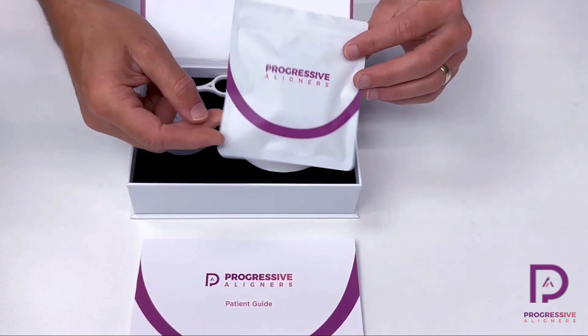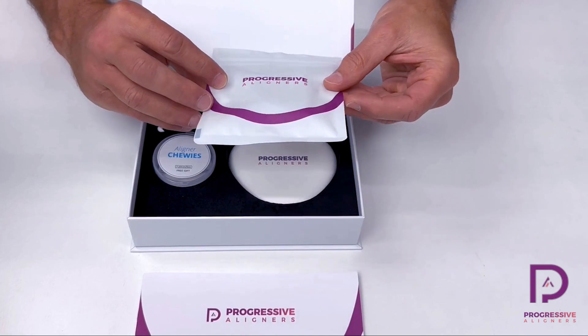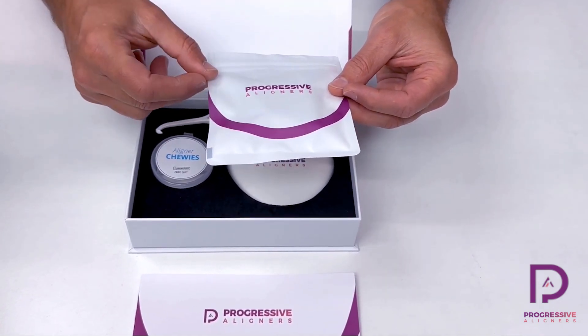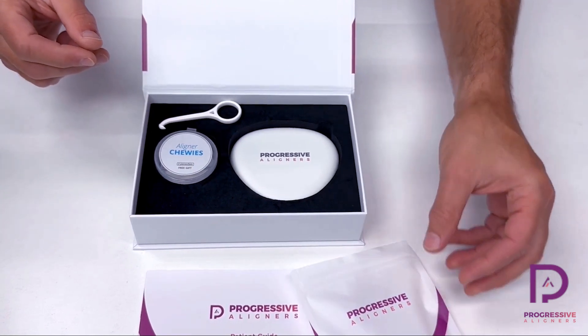You're going to give them a pouch, or however many pouches of aligners that you want them to take home to use before you see them the next time. That will have the patient name and number — for example, five of 15, or whatever the number in the sequence is.